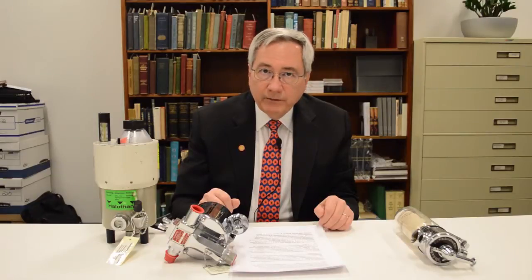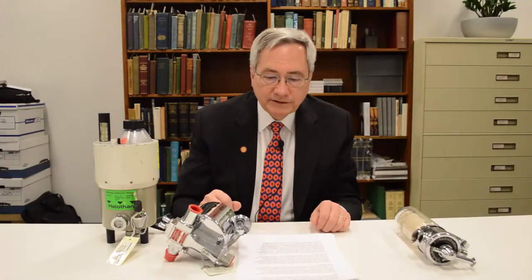I have 3 anesthetic vaporizers from the collections of the Wood Library Museum of Anesthesiology with me today. Each of these would have been available for clinical use in the 1950s. Each of the 3 is a variable bypass device that uses a flow-over method of vaporization and wicking to facilitate that vaporization. They differ in other ways.